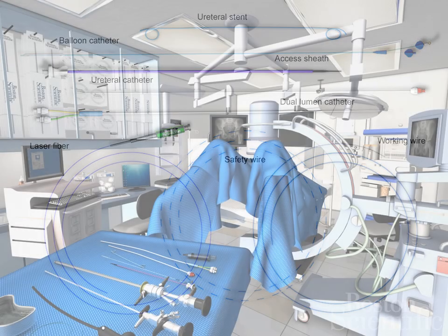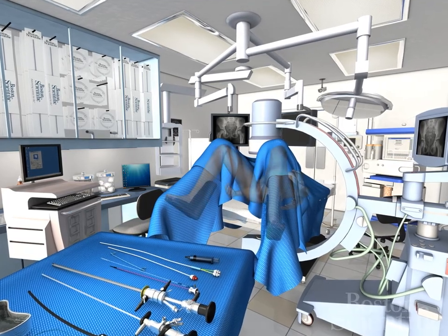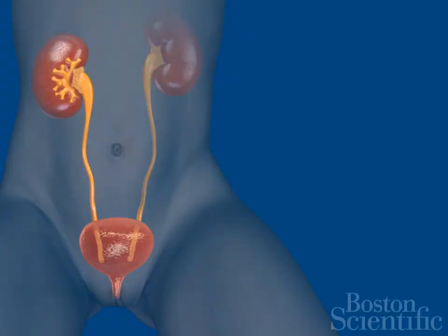This video will demonstrate stone management with ureteroscopy. This patient has a stone in her right ureter. The common steps of ureteroscopy are as follows.